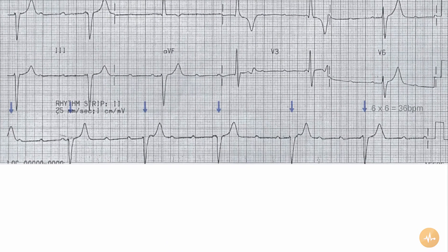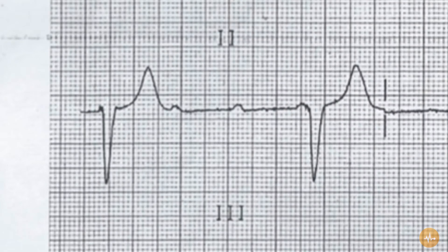The rate is 36 beats per minute. The rhythm is complete heart block. Organised atrial activity, P waves, are clearly visible in lead 2, but these bear no relationship to the QRS complexes. This can be clearly identified by the very variable PR interval and the fact the P waves march through the QRS complexes.